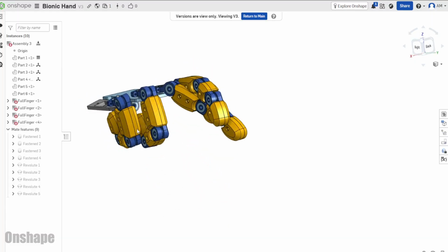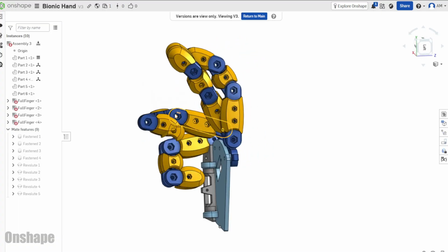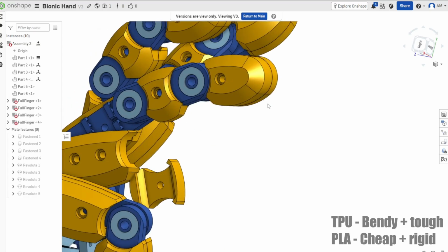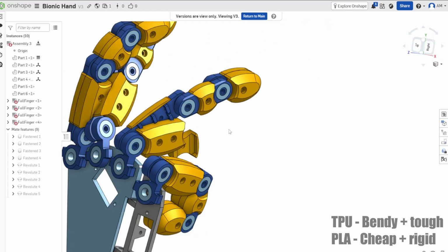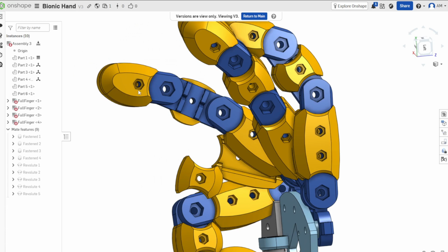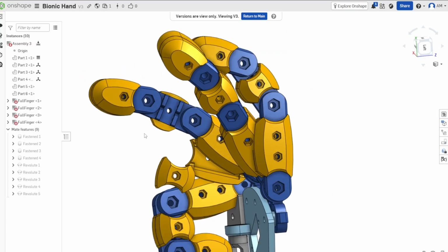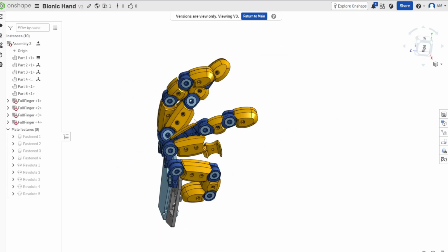So let me show you what I've been working on. Here's an older version. I just wanted to show you what the full aesthetic version of it looks like. So it's kind of broke. These orange bits would be TPU, blue bits are PLA, these are bearings. So it allows for a pretty smooth motion, as well as soft grasping, and if you just print with the right TPU, you're going to get good grip as well. But it's compliant, right? It feels more like a hand as opposed to a robot or plastic.